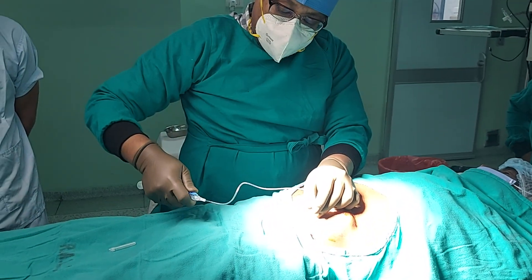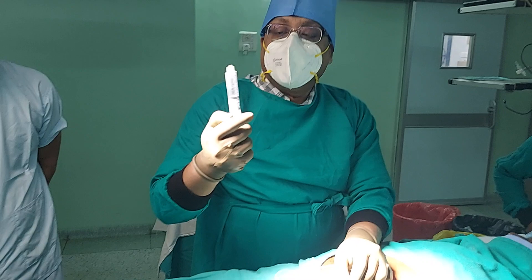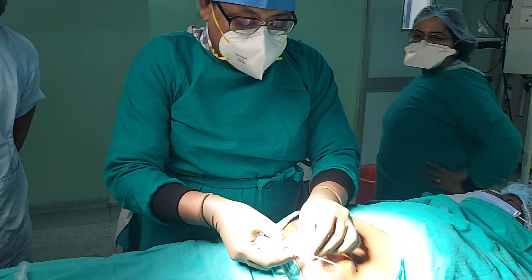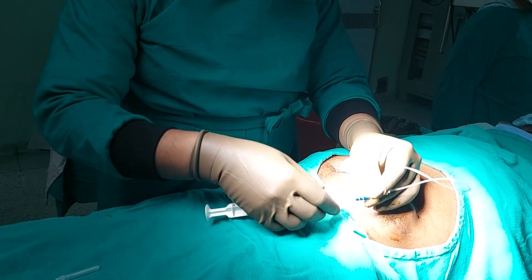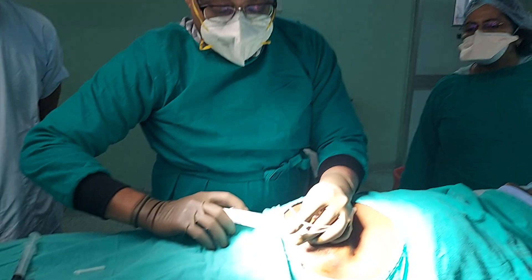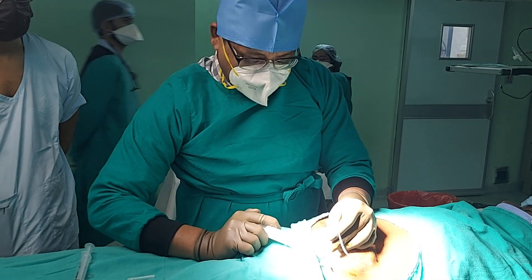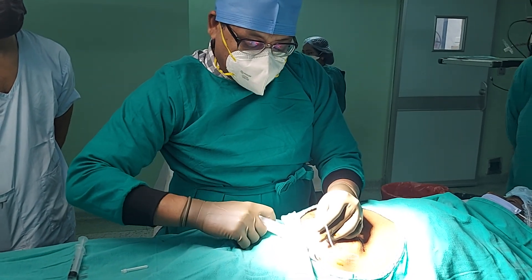Now we are going to remove this syringe and discard it. Holding the needle in place, we are going to attach another syringe which contains the solution of morphine and normal saline, and we change the lock to the on position and inject. It is going tight because this pump is pressurized — that is the beauty of this pump.